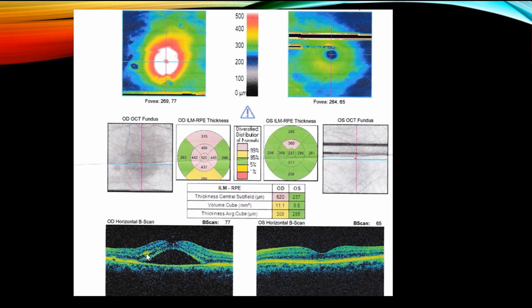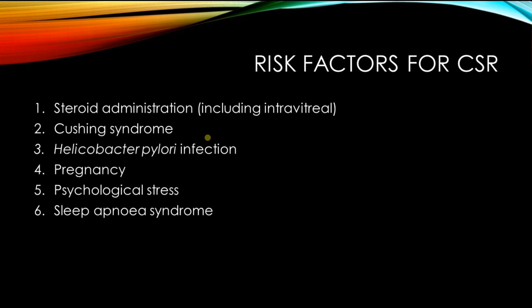The typical outer nuclear layer and outer plexiform layer appear to be in their usual shape. The thickness is 520 microns in the central area, and it is also involving the perifoveal area at 445 and 442, going up to the superior area.